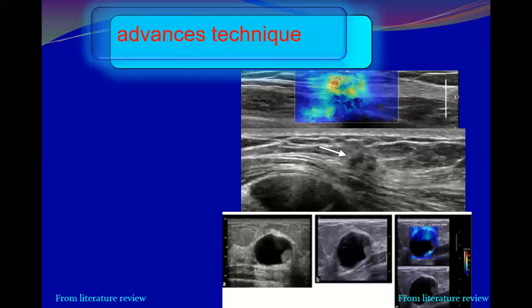That means this color represents, the blue color here represents soft tissue. Even the surrounding tissue is soft, totally soft. So the nodule is presenting a green color, I think borderline. It is blue. It is soft.